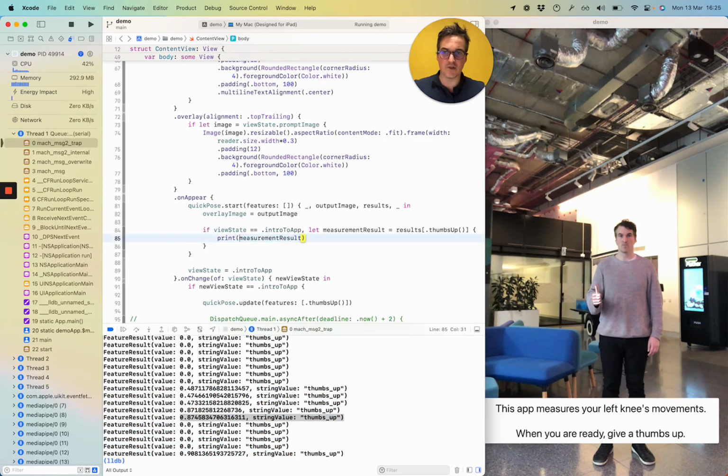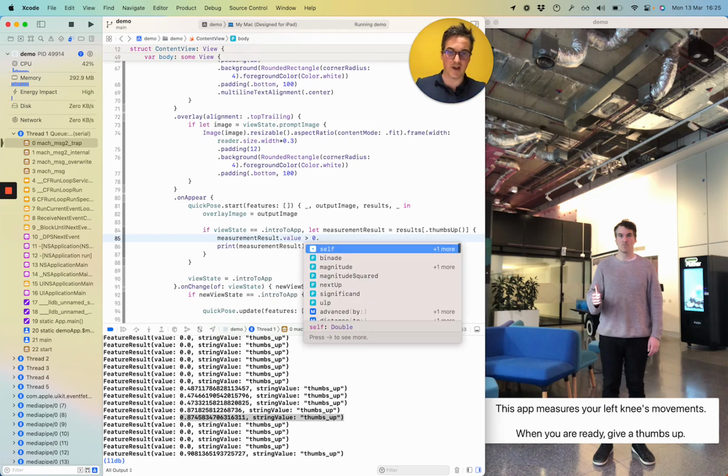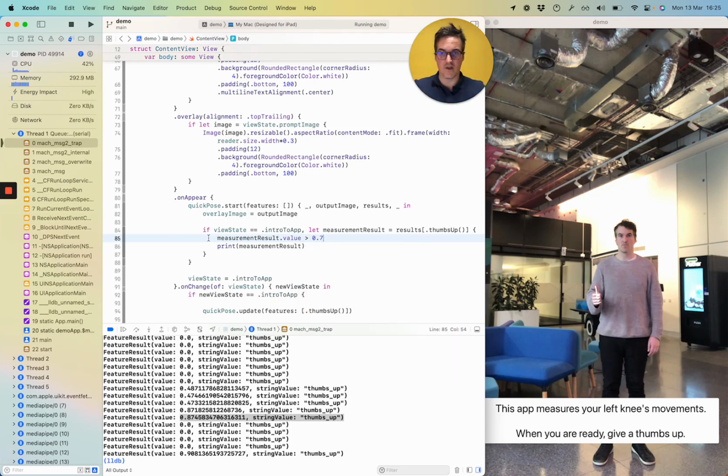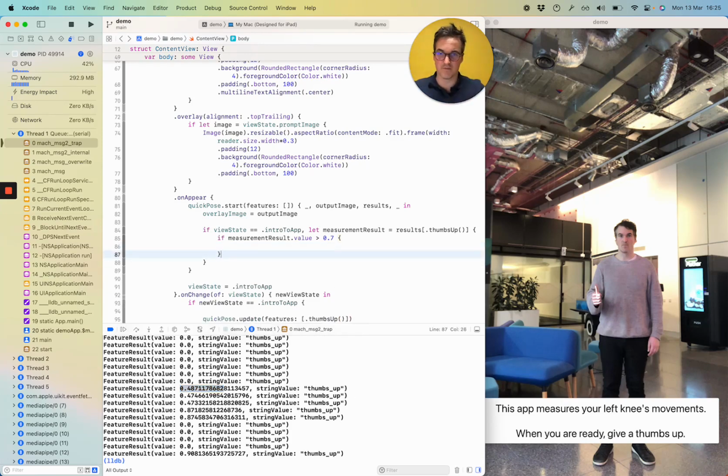So I'm going to say measurement result value needs to be bigger than, say, 0.7. And if it is, then I'm comfortable that that's a thumbs up. I could allow 0.4, but that might be something like that. I kind of want a real clear thumbs up. This is probability, not angle. Bear in mind, probability works a bit differently because that's an AI feature.